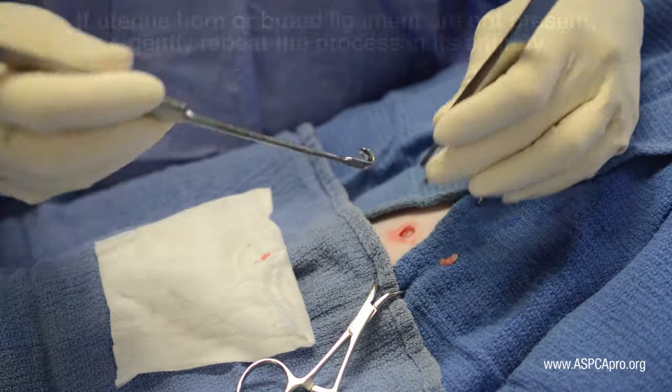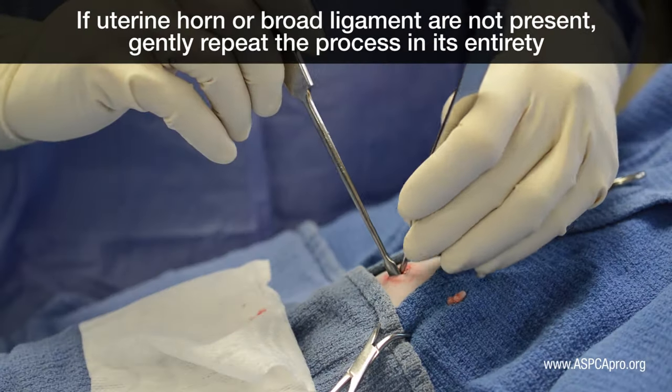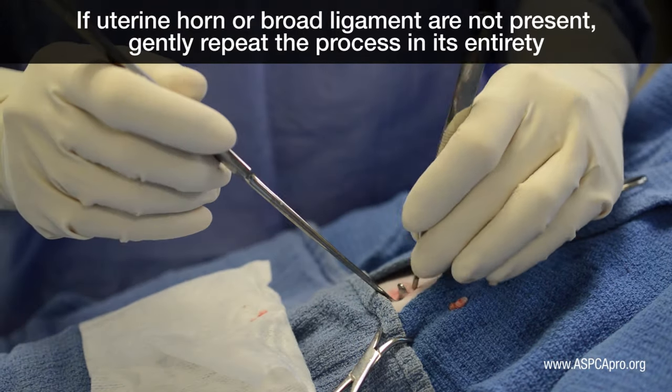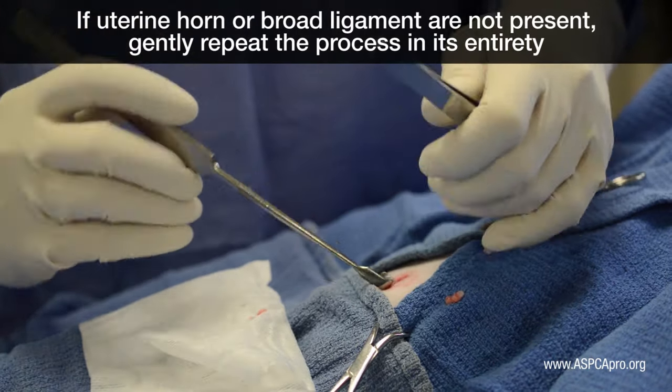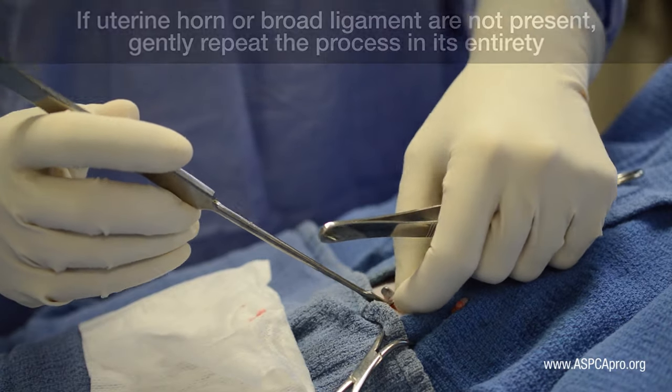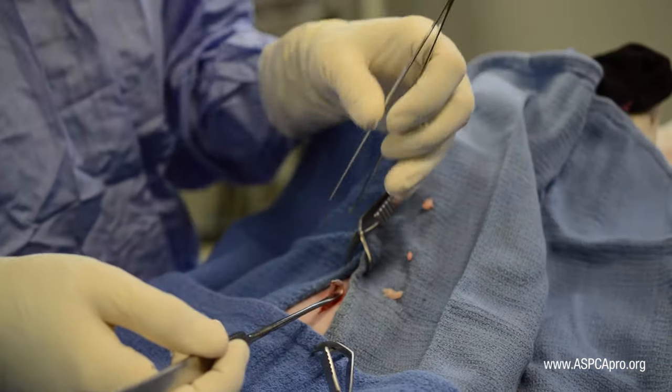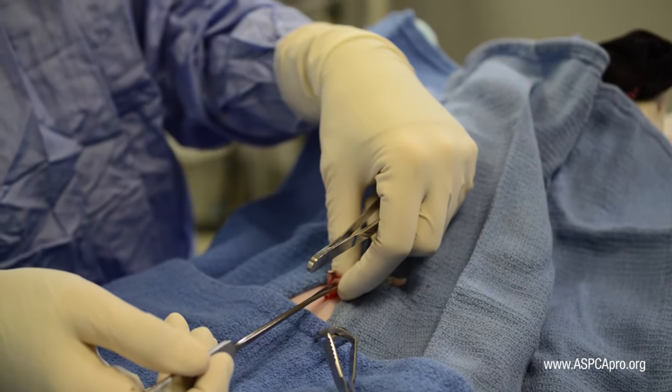Thumb forceps may be carefully used for this step unless intestinal tract is present on the hook. Place the tissue not associated with the reproductive tract back inside the abdomen. Be cautious of tearing, poking holes in, or otherwise damaging tissue. Look for the uterine horn or broad ligament.